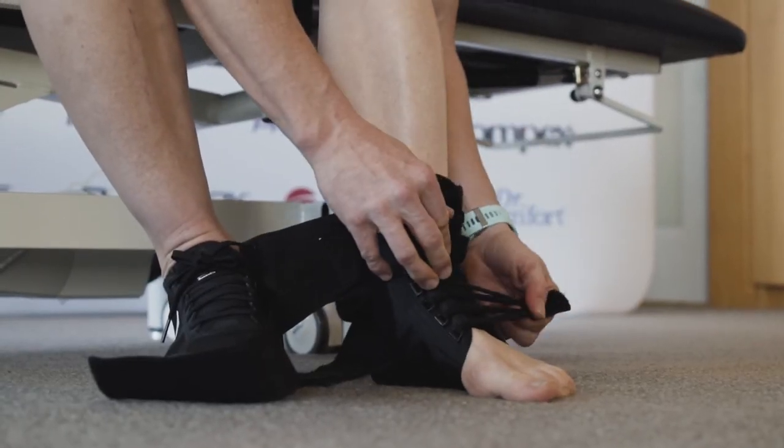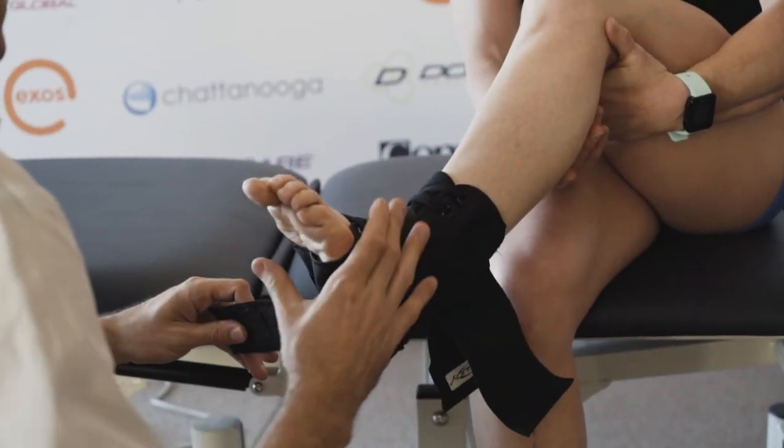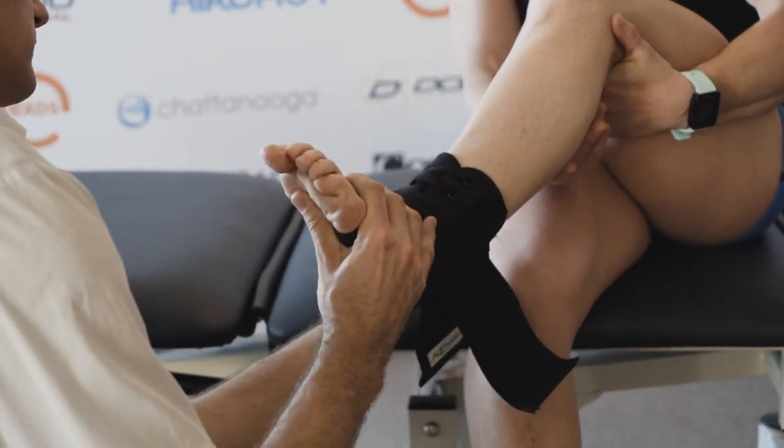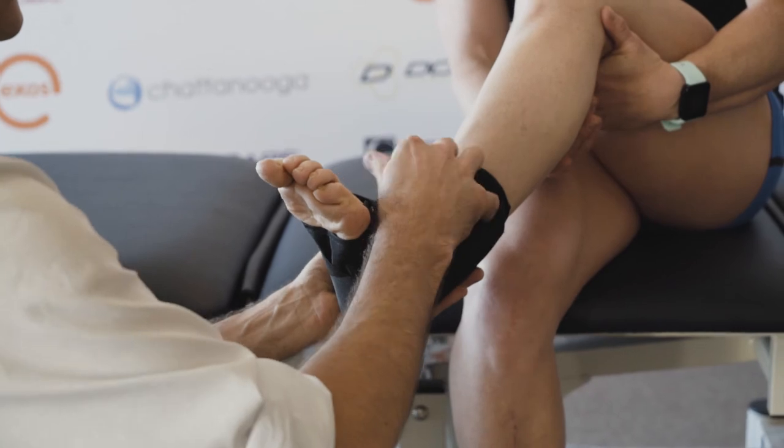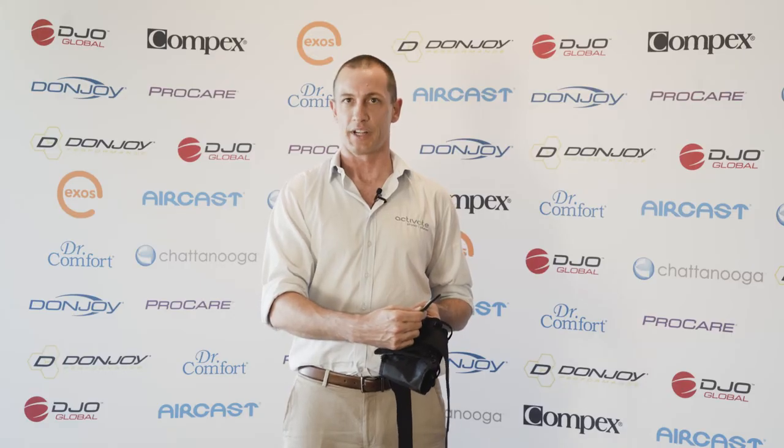You've got rigid stays on each side which are removable, and rigid straps which you can put over in a medial and lateral direction. To finish off, there's a closing strap suitable for high ankle sprains.